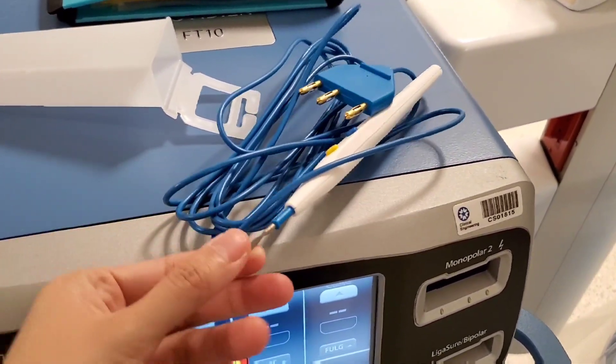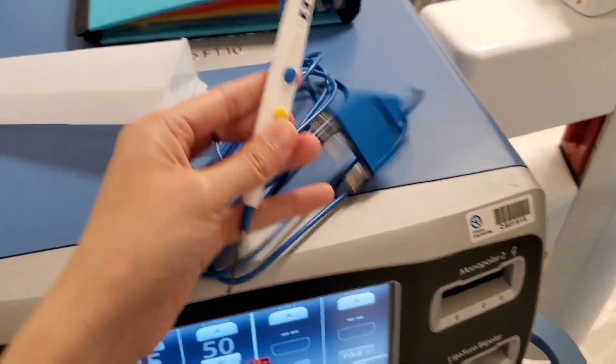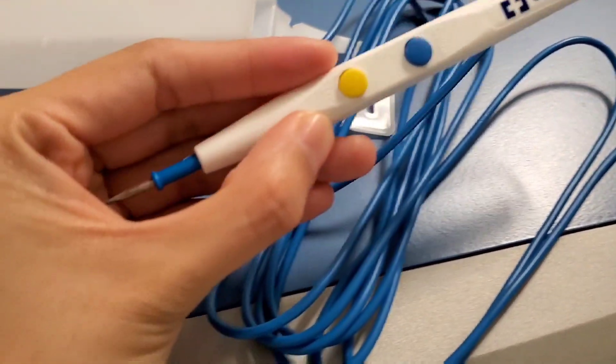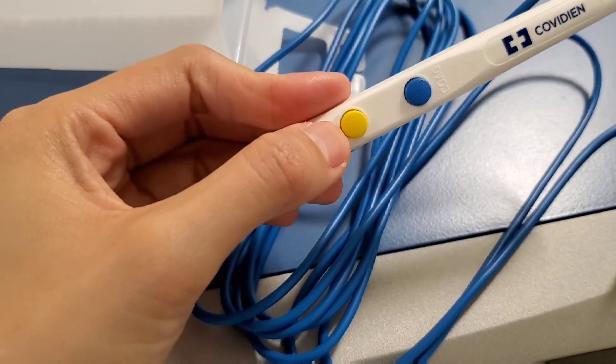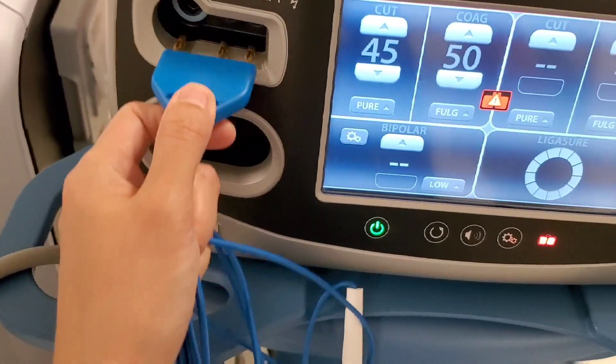There was a plastic thing that was covering this and I already threw it away. This is what it looks like. The blue is coag, and the other one is cut. So you pass the end to the nurse and she's going to plug it in.